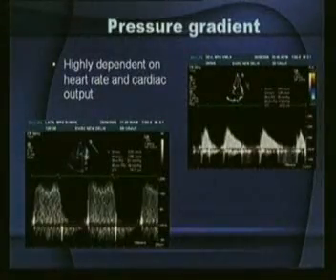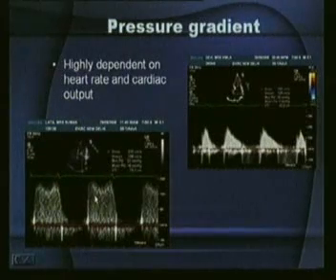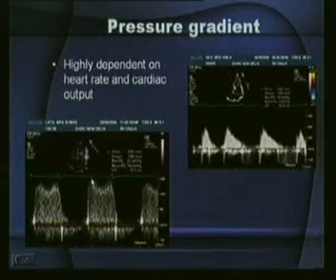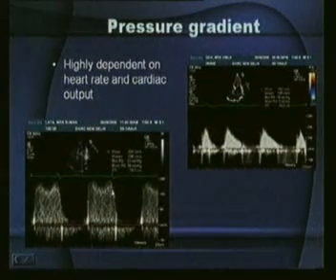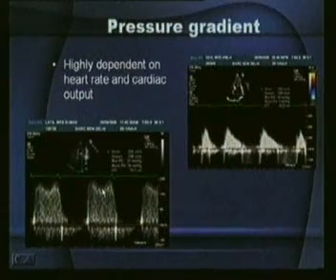Having seen the normal, having seen that we have got this tracing, having taken the color gain, having put the color Doppler on, and having positioned the continuous wave Doppler beam very parallel to the color Doppler across the mitral valve, now look at the E and A wave. They've disappeared literally, isn't it? There is no diastasis. It's so high. This is severe mitral stenosis.